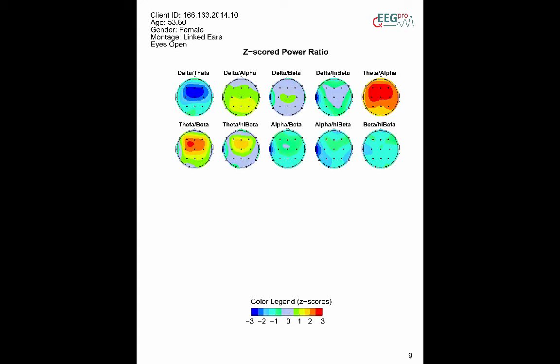The power ratio analysis shows the z-scores for the most common power ratios. Both the relative power analysis and the power ratio analysis are derivatives of the absolute power analysis. It is unadvisable to use these analyses as a basis for your hypothesis without looking at the absolute power analysis first.